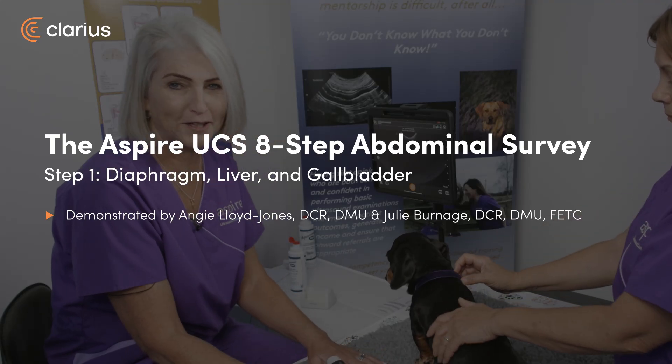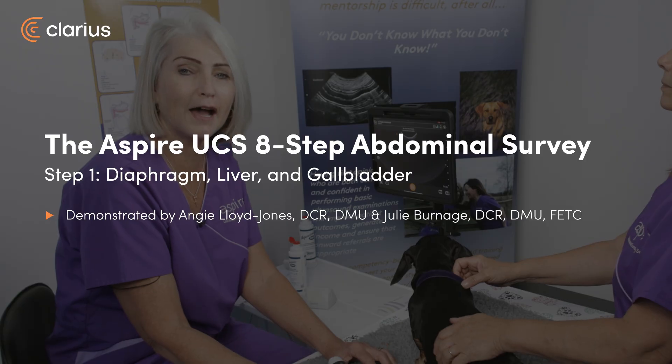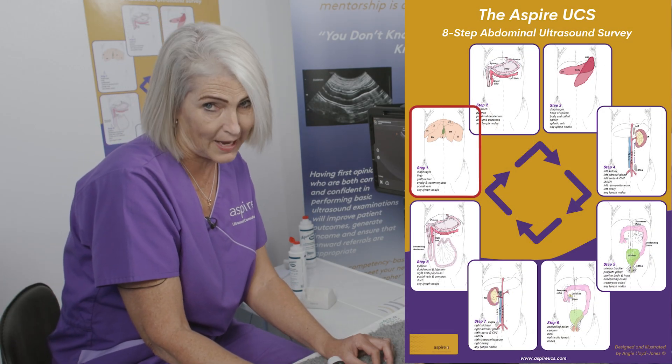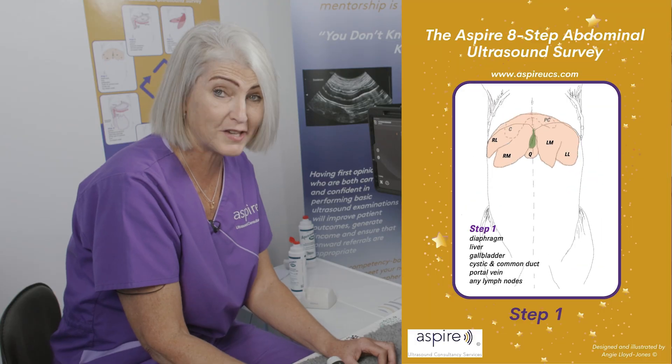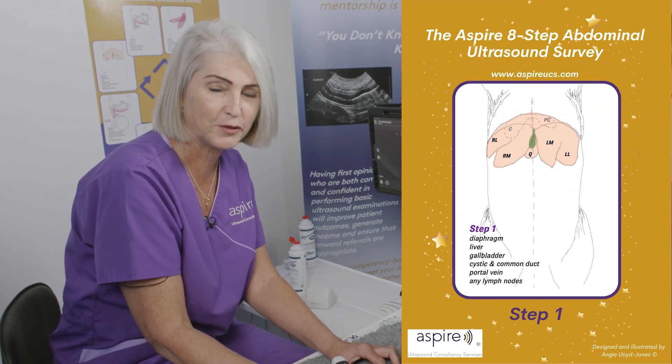Hi, I'm Angie from Aspire UCS and today we're going to cover step one of our eight-step abdominal ultrasound survey. In this step we are going to cover the diaphragm, the liver, the gallbladder, the common duct, and the portal vein.